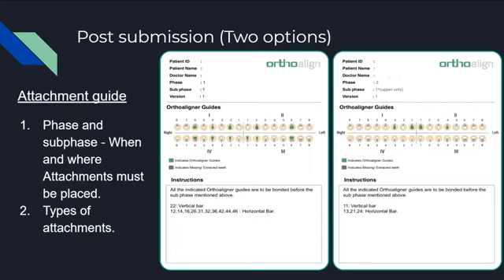Of course, with aligners, there are still patient-selected cases that you can do and you can't do. Some cases can be very hard, especially if you're going to incorporate TADs, extractions, correcting severe crossbite, for example. These are going to be very difficult with aligners.